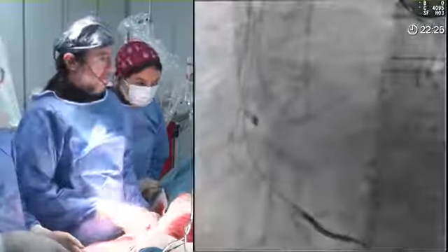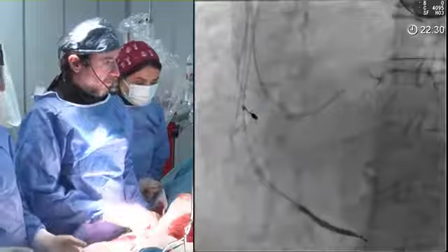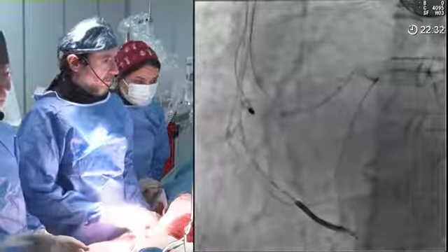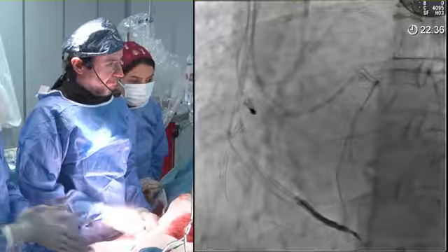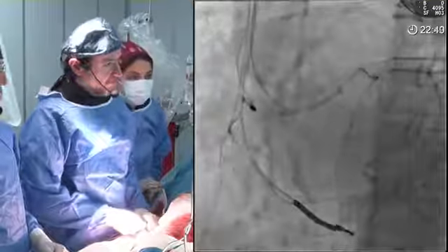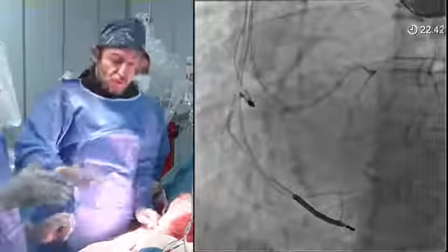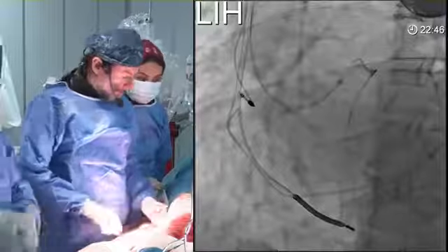Okay, Stefan. Just have a quick suggestion here. What I like in these ostial cases, I totally agree with what Cal said so far. As much as I love transradial, in this case, going femoral, it's not only the support, it's the fact that your guide will be moving in phase with the breathing.